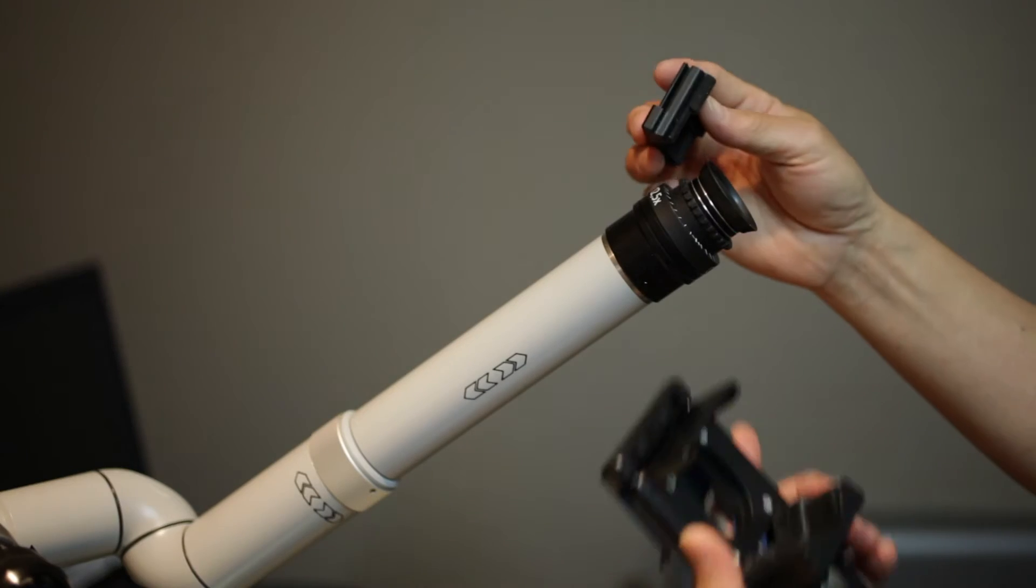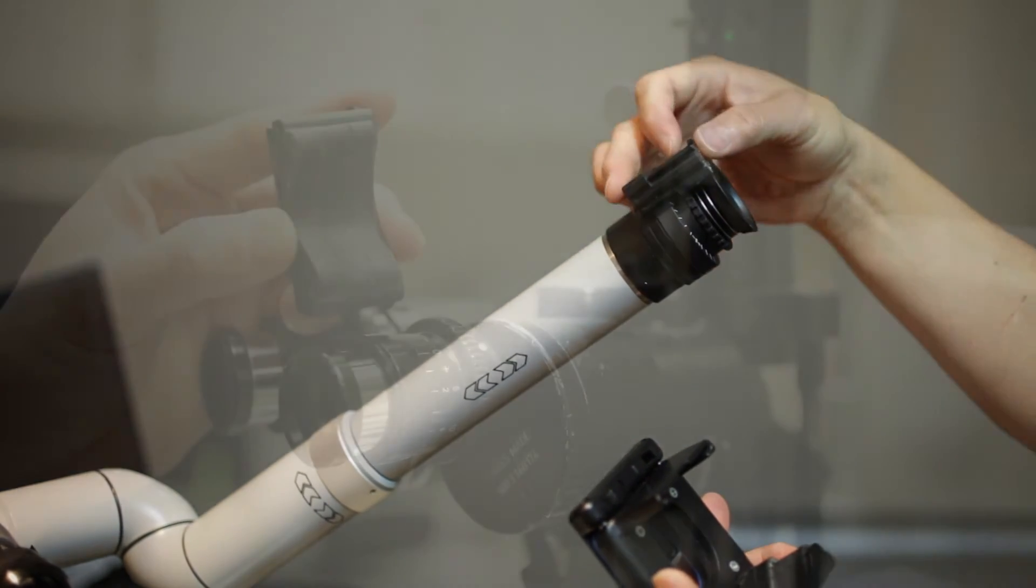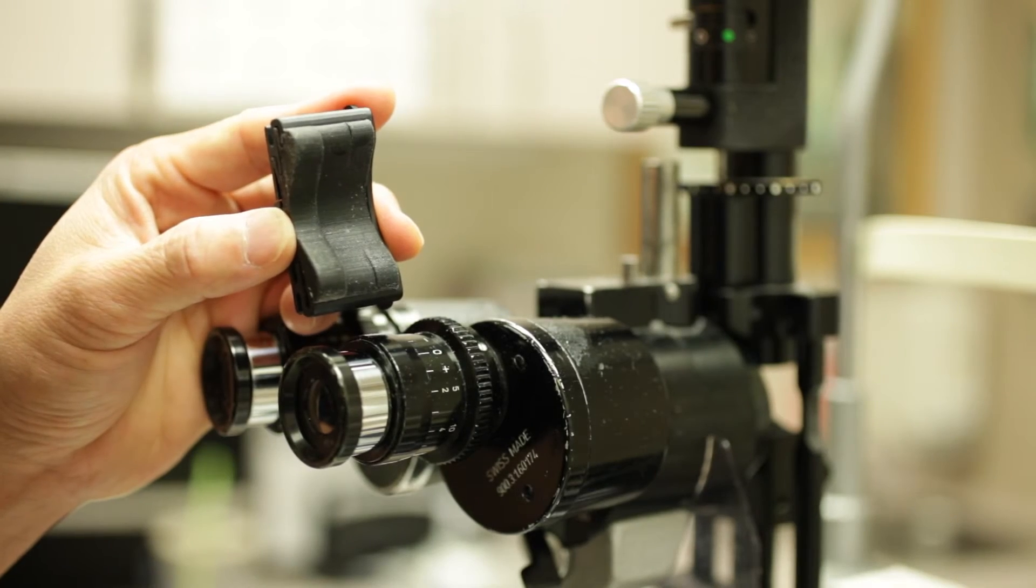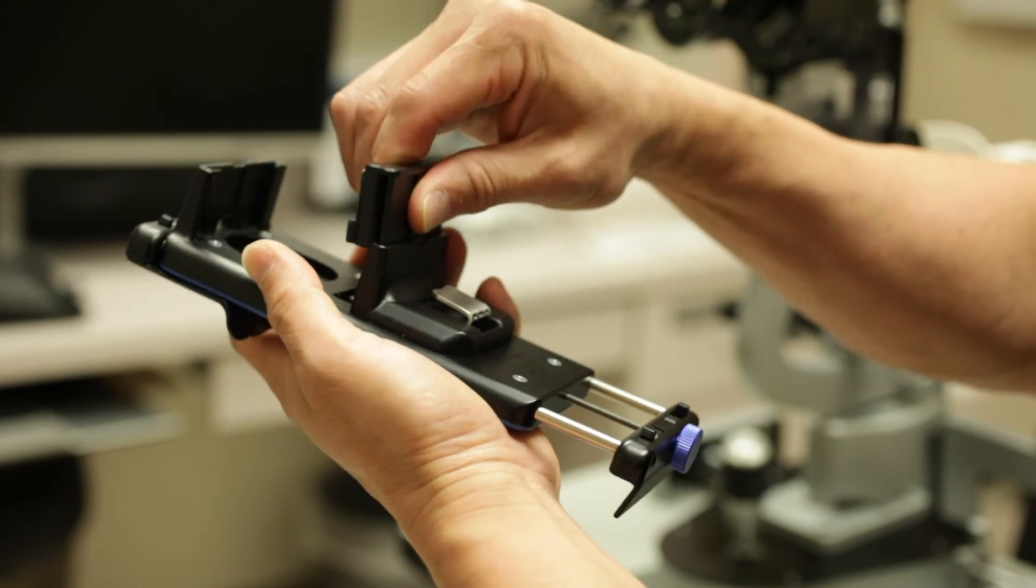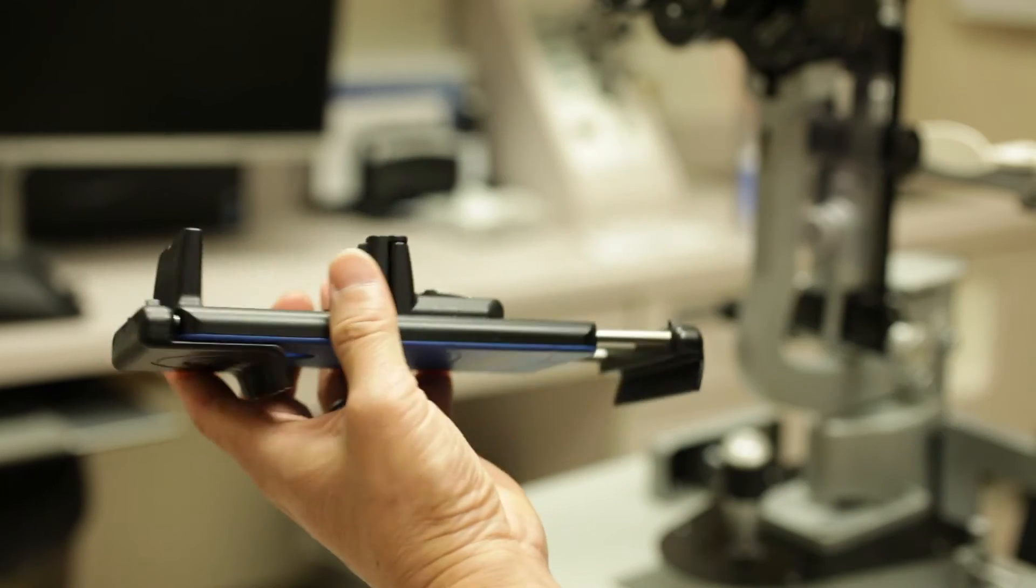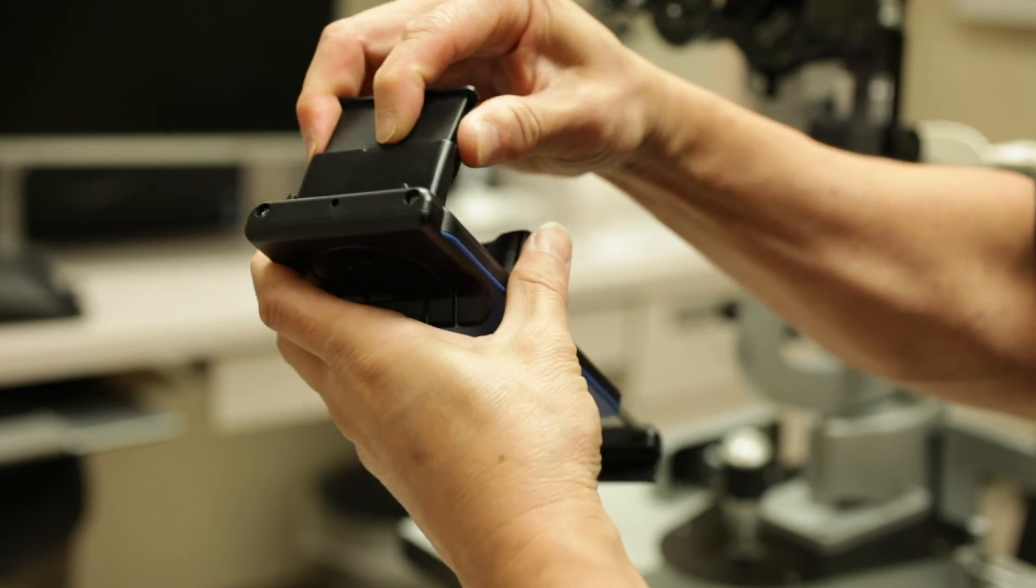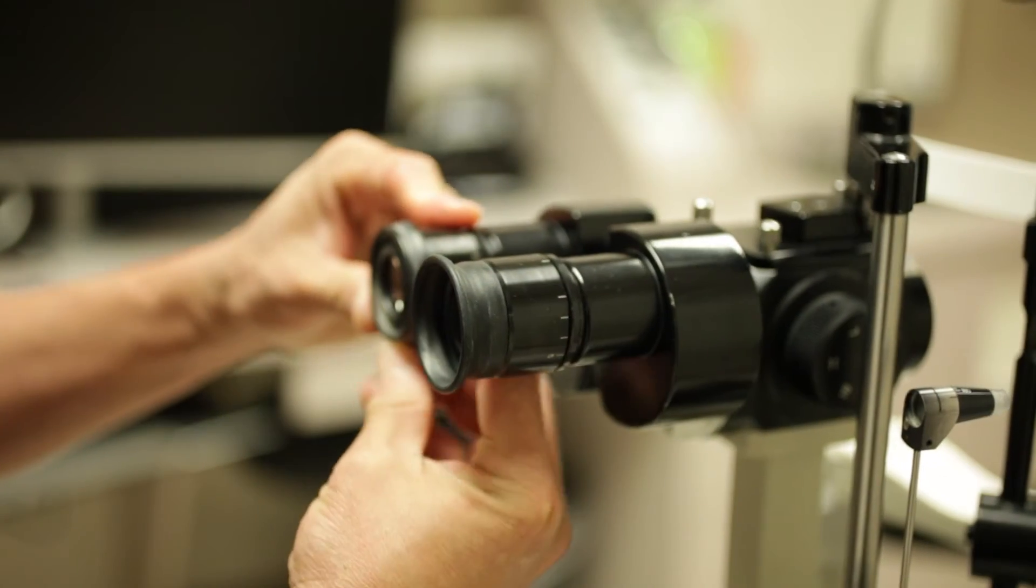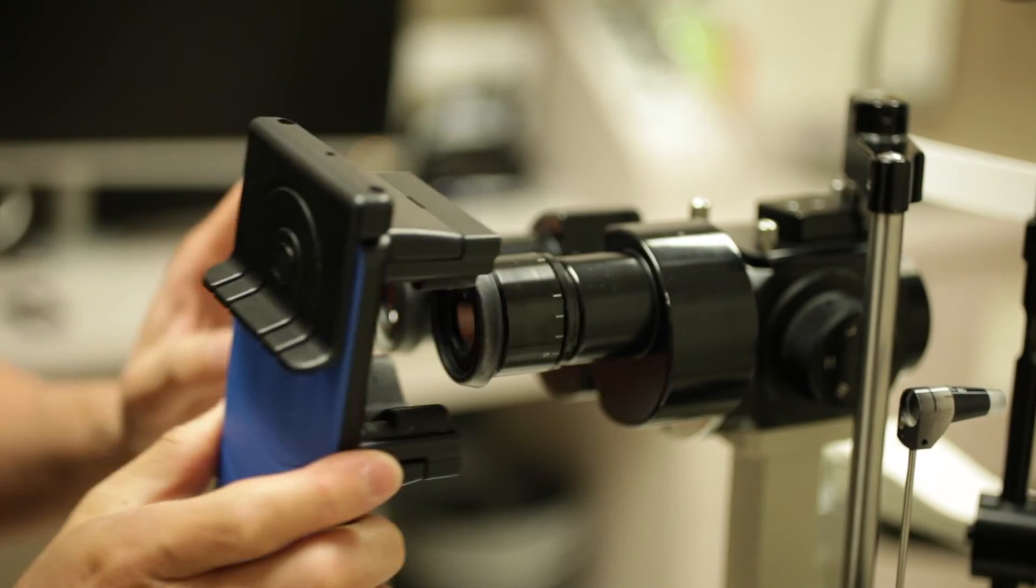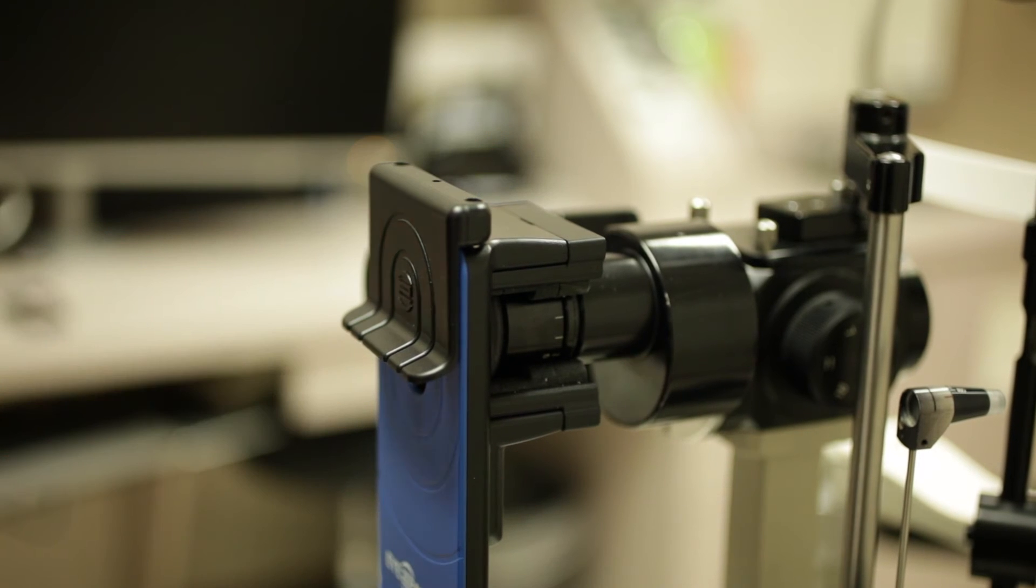Select a compatible jaw to work with your microscope. This will ensure a proper fit. Clamp the jaws onto the eyepiece.